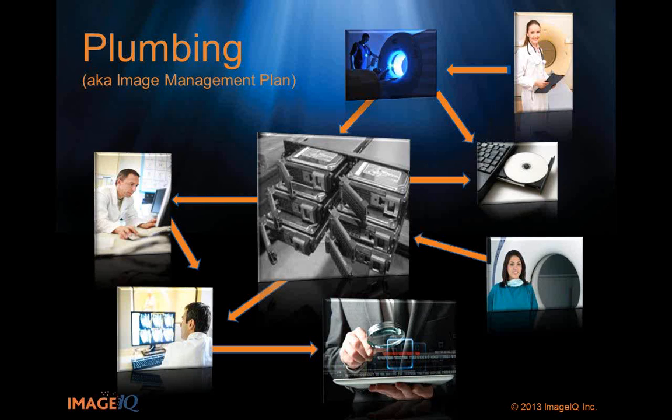And take the time to make a diagram like this that describes the protocols. One of the arrows might say DICOM on it, but one of the arrows might say FedEx, and that's okay. That may be how it is, and we run into that a lot. You have hospitals with IT policies where they're just not comfortable sending this stuff over a secured virtual private network, or secure DICOM over the intranet. That's okay. You just have to make sure CDs get labeled the right way, burned the right way, and shipped to the right place.